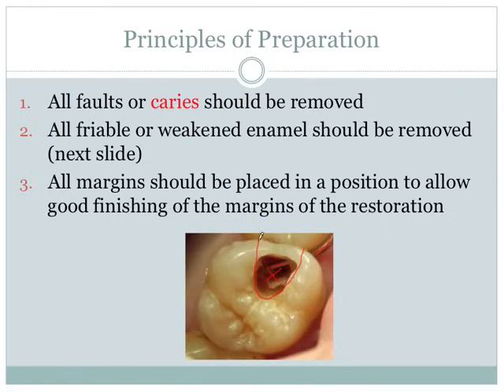Also, you want to make sure that you can access the sides here. So when you fill up this cavity here, you can access these side margins, and also polish them, finish them properly, so there aren't big ledges and big gaps that you could have leakage through. So you want to allow enough clearance between this margin and the adjacent tooth.